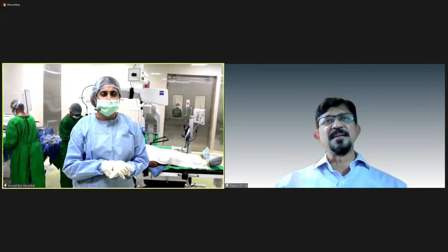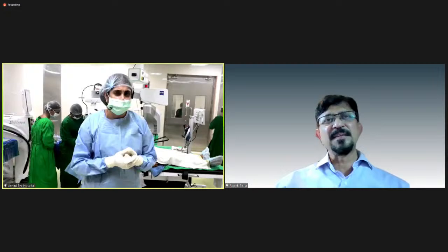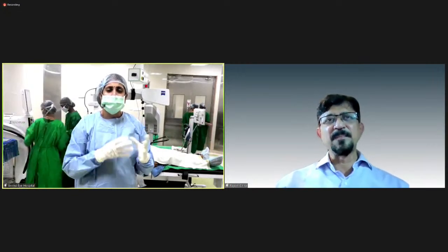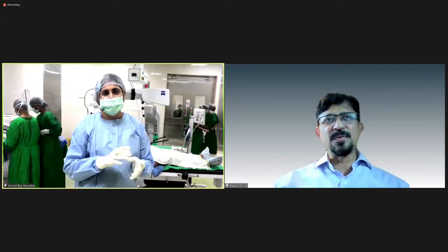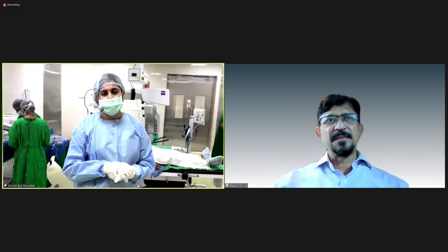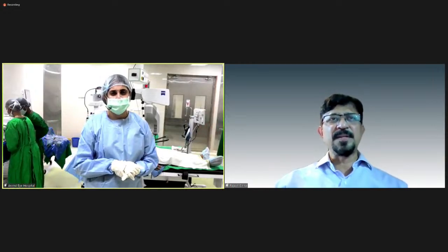But of course, the iris can be a little bit more floppy in a myope, so there's a higher chance of pupillary constriction and things like that. Yeah, so the fluidics also plays an important role. To have a good fluidic system, so your chamber is stable and you don't have too much iris fluttering. Very true.